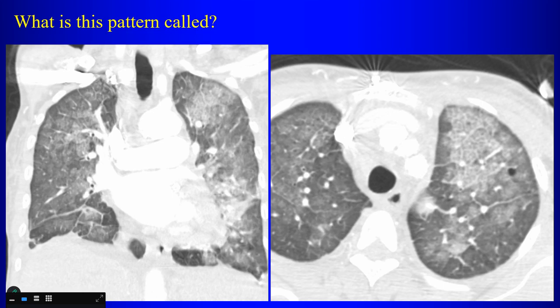Yeah, pneumocystis pneumonia, right. Pneumocystis pneumonia can also give you crazy paving. So we talked about pulmonary edema. There are other, more unusual things too, like lipoid pneumonia. There are case reports of mucin-producing adenocarcinoma giving you crazy paving also. But pulmonary edema is the most common cause, and in terms of infections, viral pneumonias and pneumocystis pneumonias give crazy paving.